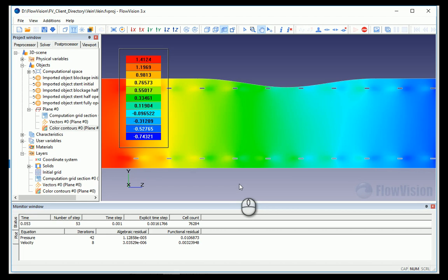This is possible, and also, as we describe in different mediums, it's possible to run this simulation as a fully two-way strongly coupled fluid structure interaction case where the stent is deformed by means of blood pressure and by means of external forces or pressure stresses. That's all possible. And the idea is in all those cases, FlowVision treats those bodies as not moving but deforming, similar to what we have been doing here. So the same ideas apply.